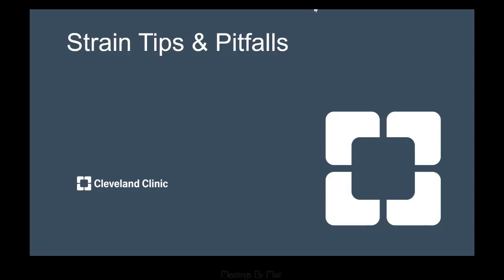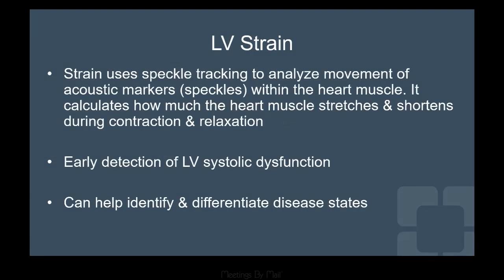All right. So just to kind of tie, does everybody hear me there? Tie together the strain tips. Just super quick, a couple slides to make sure everyone's on the same page about how to perform good strain. Of course, we know what LV strain is. It uses the speckle tracking to help us interpret LV function. Keep in mind, I work with a lot of junior sonographers that come into our lab, and they have a lot of questions about strain because if the EF is normal or abnormal, they always question what their strain values are and if it's tracking right and everything.